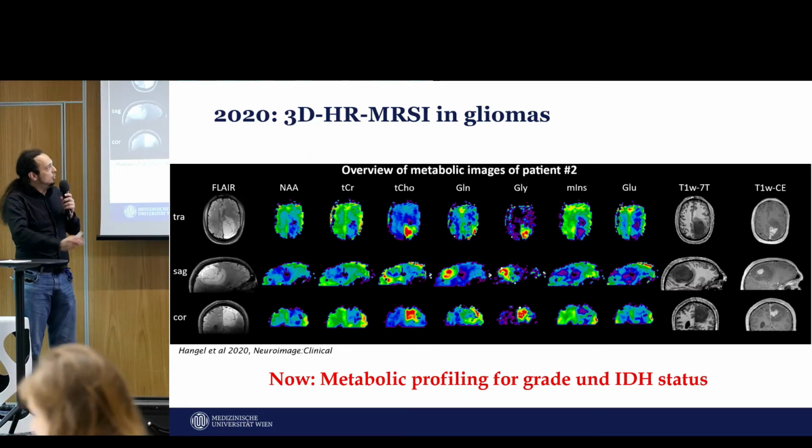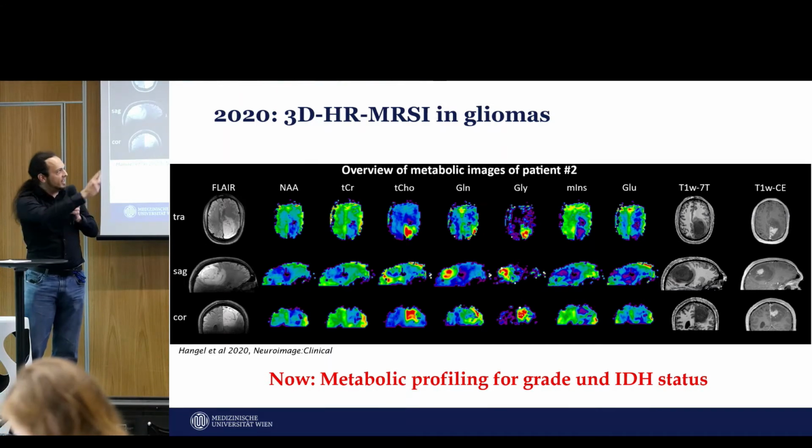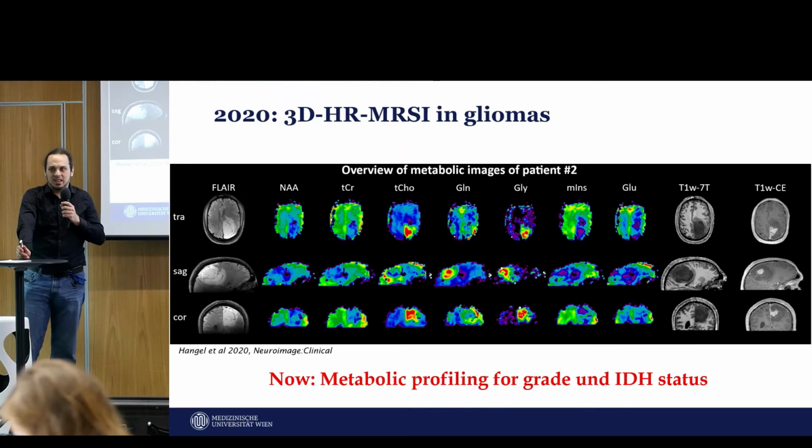Also, a highlight here would be glycine, which is only separable from inositol with great effort in the next row at lower fields. You need specific methods for that, which might or might not work. We think we can separate it very nicely at the high fields. If we had glycine and myo-inositol together, you would not see anything special, or you would not see the glycine at all. And if we extract the glycine, we have this very nice hotspot there too. And also you see with glycine in the healthy brain, you still at 7 Tesla cannot really fit it at all. The concentration is under 1 millimolar. So that's one of the things that you only see really in the tumor.